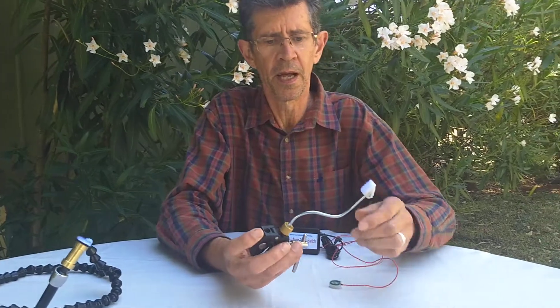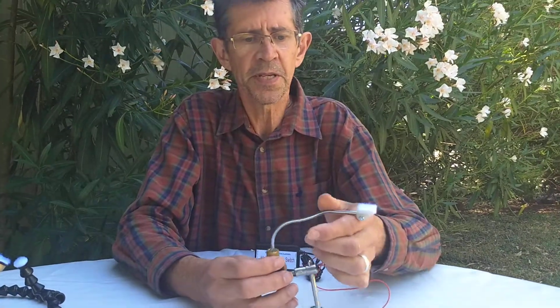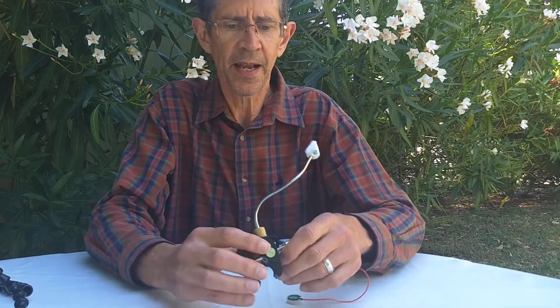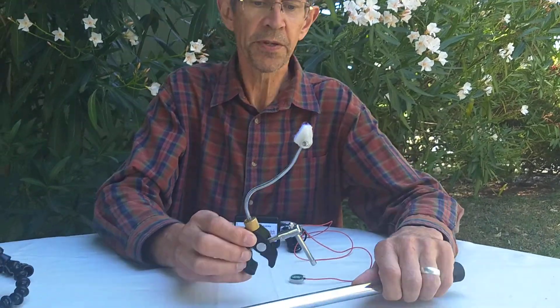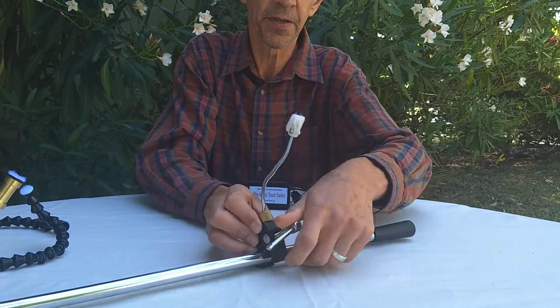The first mount is this little mini gooseneck arm. It has a clamp on the end that can clamp onto rails. I'll show you how we've used it on a wheelchair — we can clamp that onto the rail.